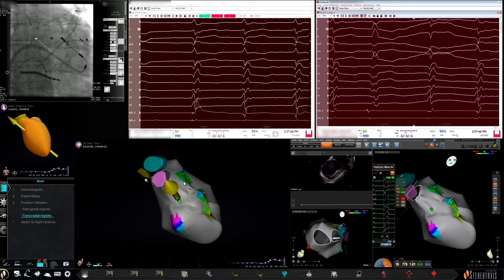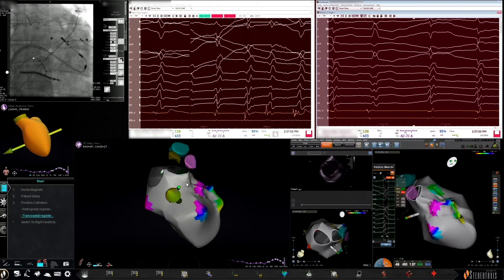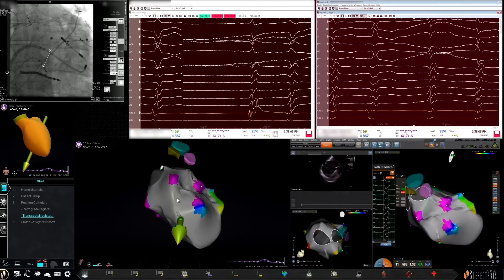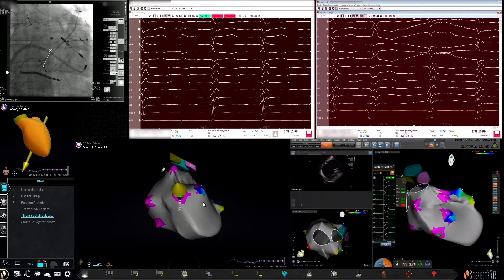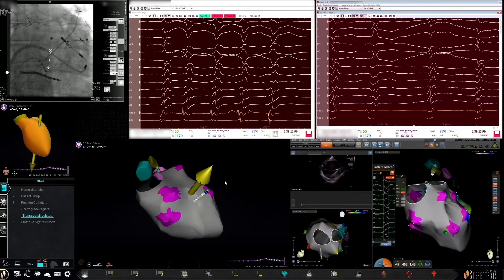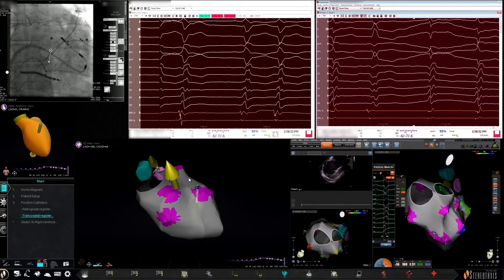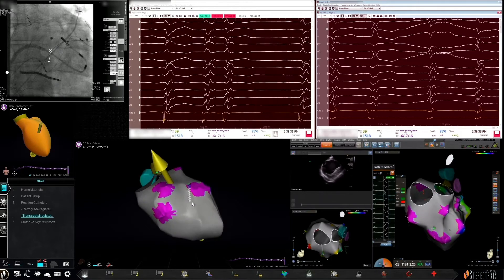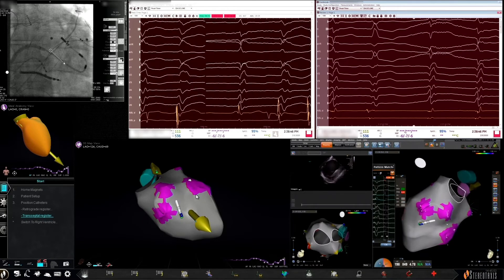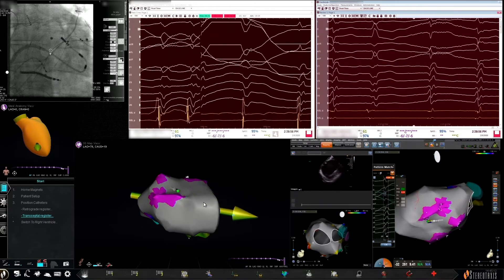Based on the patient's history of coronary artery disease and previous LAD infarction, this map showed a potential area of interest in the anteroseptal region. Other areas, including the inferior wall and inferoseptum, appeared to be spared based on the initial mapping. Use of the patient's sinus rhythm as a template map allows the CARTO system to automatically ignore PVCs and other beats, so that manual points in addition to automatic points taken during mapping can all be used.